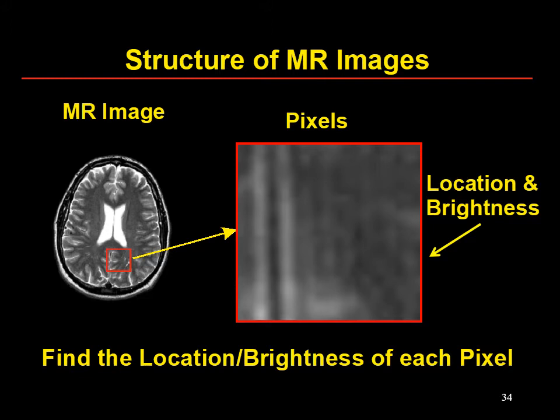First, let's look at the structure of an MR image. An MR image is a digital image that is composed of pixels representing voxels with a certain grayscale in a certain location. MR, like all digital modalities, has the same image problem-solving issue.